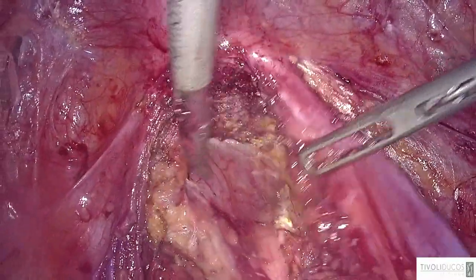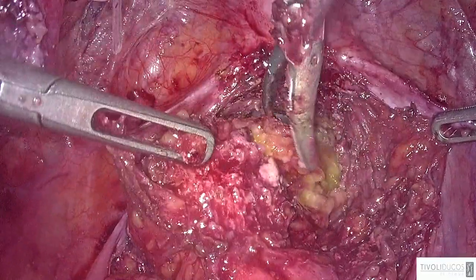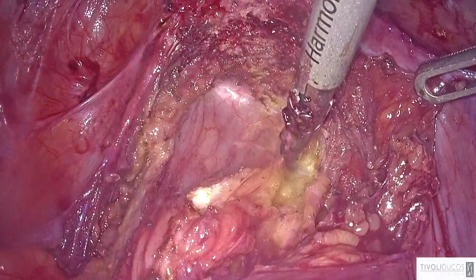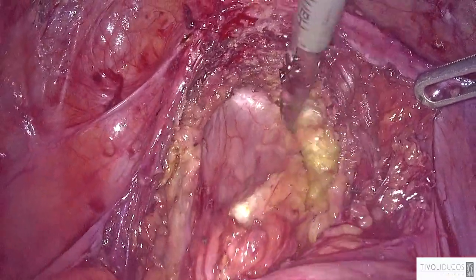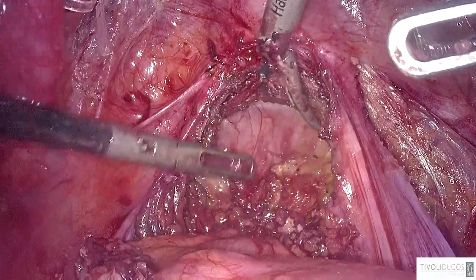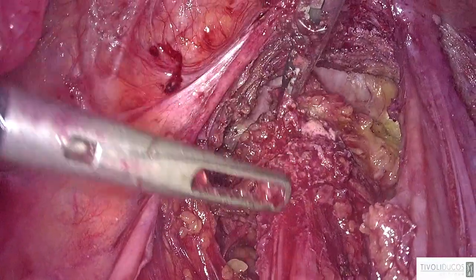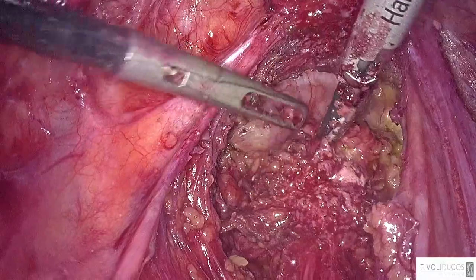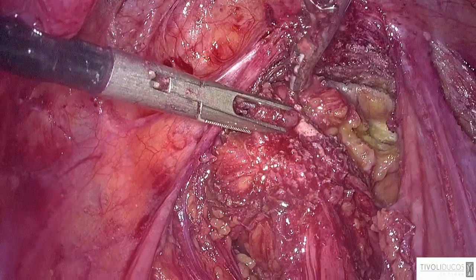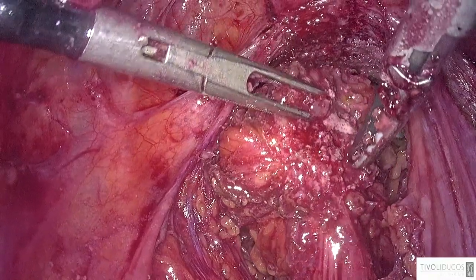So my advice is to do it from the lateral side, and once the lateral side has progressed, you can cut on the midline. So this is the nodule, okay? And here we do not need to dissect more, because we are more likely to cut some nerves here. So we'll leave the rectum and we'll come back at the end to do the disc excision. The disc excision is absolutely feasible in this case, because the length is a bit more than 3 centimeters. As the nodule is big, the length is not this. This is just the diameter. The length will be a bit larger, because the mucosa is pushed inside.